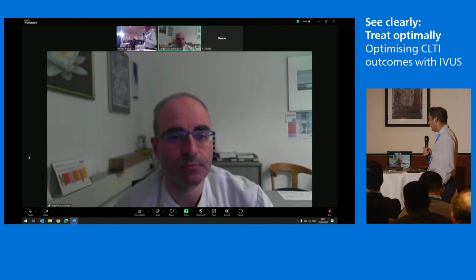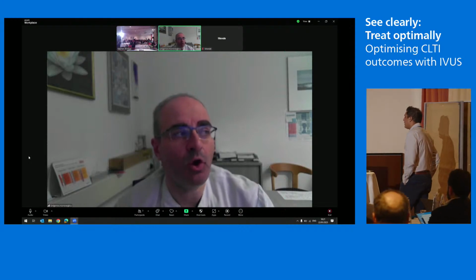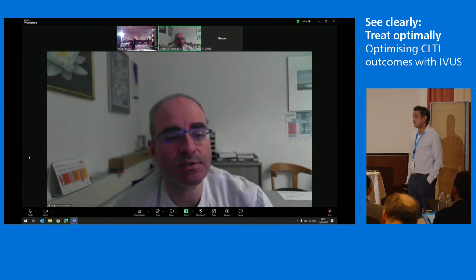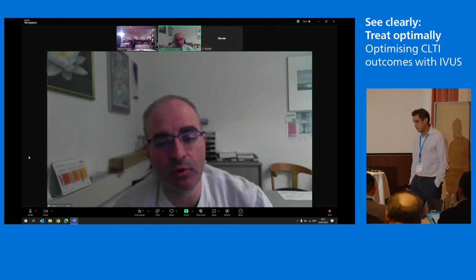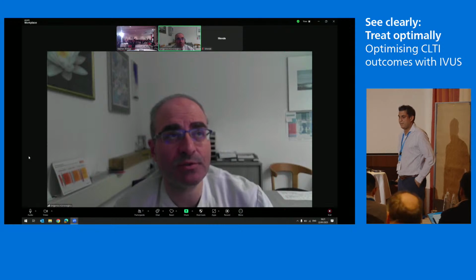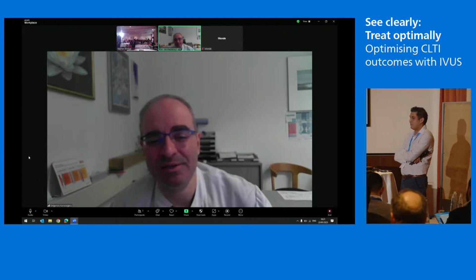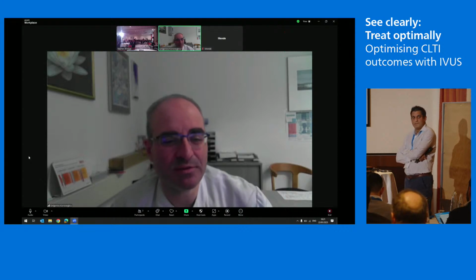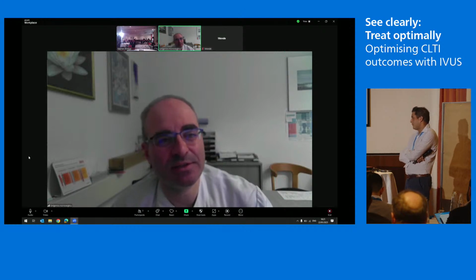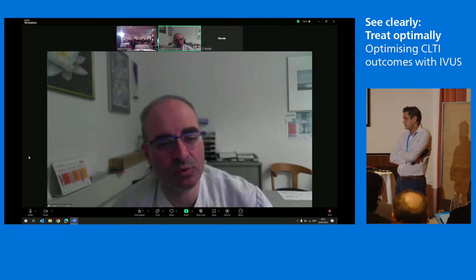Right. That's a very good question. For the common femoral artery and for big SFA and big popliteal arteries, I always prefer the 2.4. There are, of course, some patients, as the one patient that I showed, where you may have small vessels, and you may not be so comfortable with the 7 French sheath. Then an alternative is the deflecting 6 French, so a 2.2 with deflection.